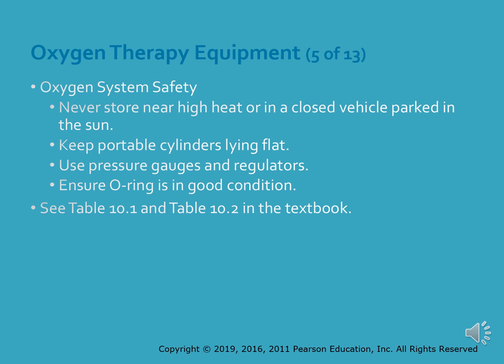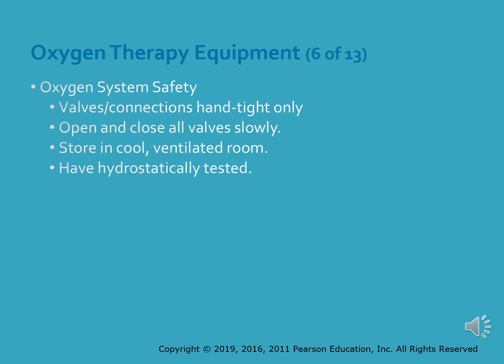Keep portable cylinders lying flat. Use pressure gauges and regulators. Ensure O-rings are in good working condition. Valve connections should be hand tight only. Open and close all valves very slowly. Store in a cool, ventilated room and have them hydrostatically tested.